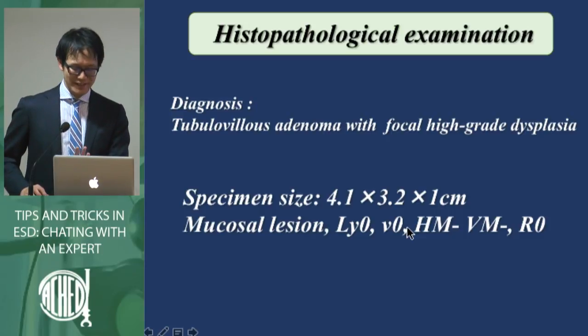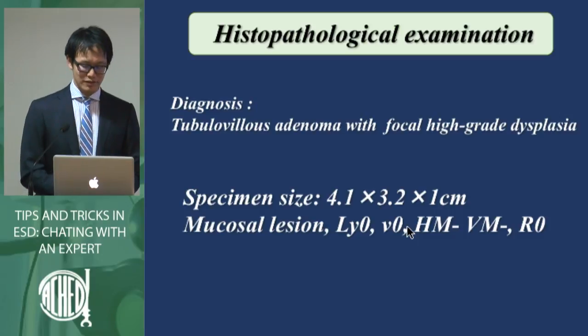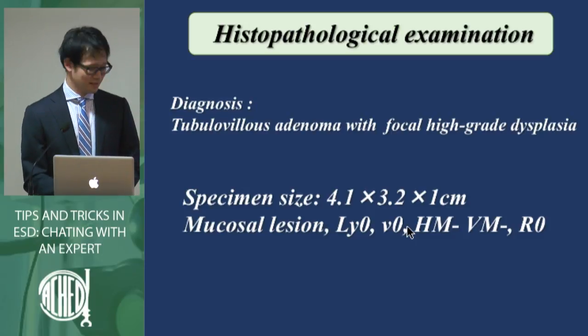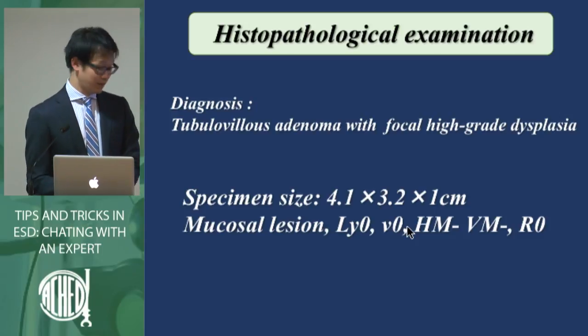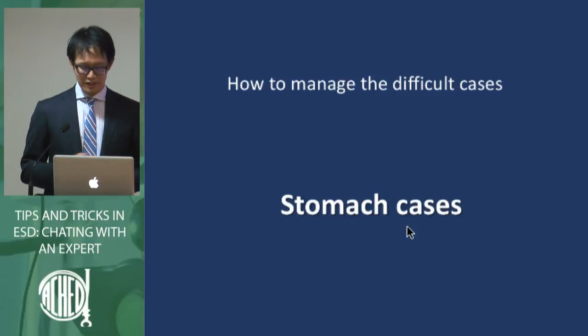So this is the Philippines ESD cases. Even so, the foreign pathologist is different compared with the Japanese pathologist. So we usually discuss the pathological examination with the Philippine doctors. If the pathological report, I ordered 2 millimeter divided evaluations of the specimen. So for ESD procedures, histopathological examination is very important.